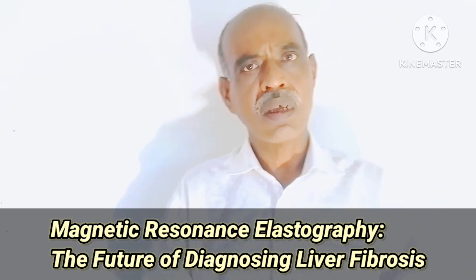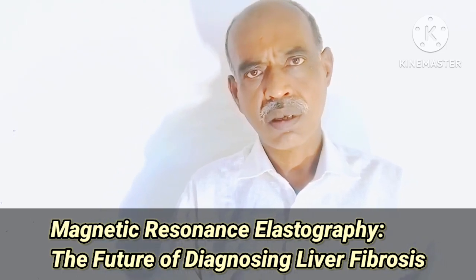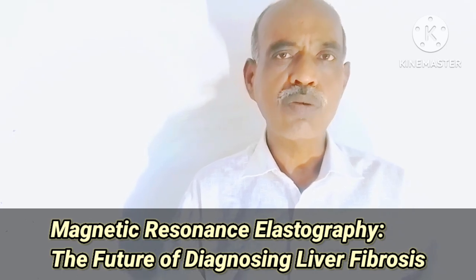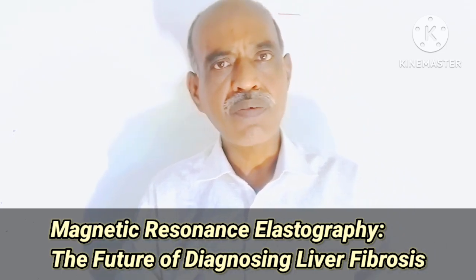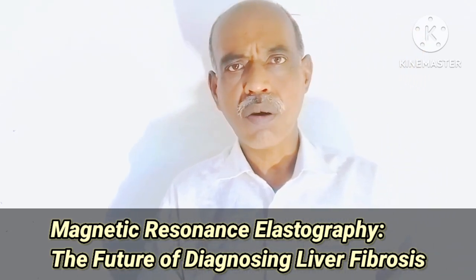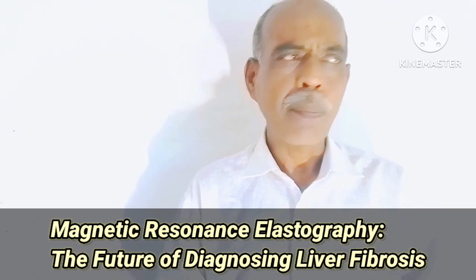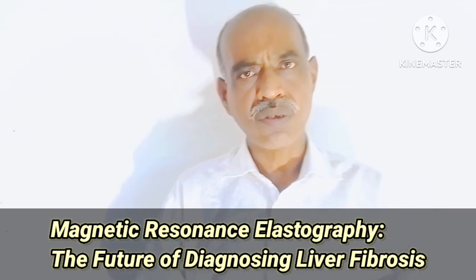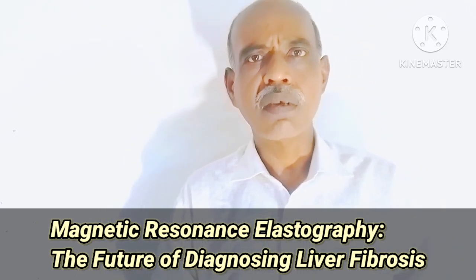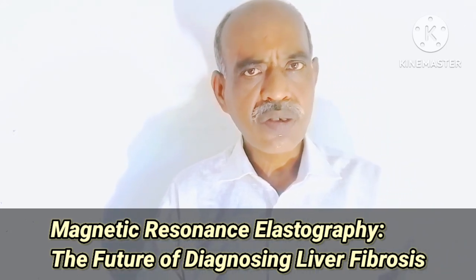What is the use of this imaging technique? Yes, of course, this is an imaging technique. Okay, so what is the use of this? It is used to measure the stiffness of liver in case of liver fibrosis. There are so many uses, all are related to liver. What happens actually in case of a liver fibrosis, the scar tissues replace the healthy liver cells, and that way the liver becomes stiff.